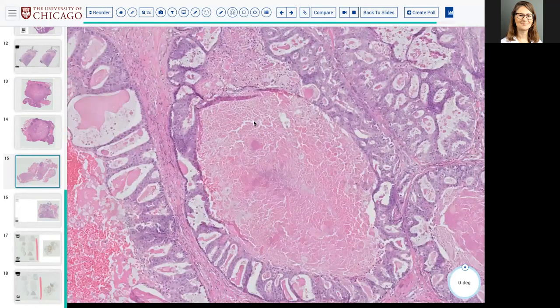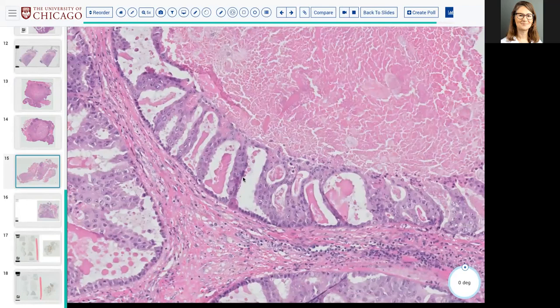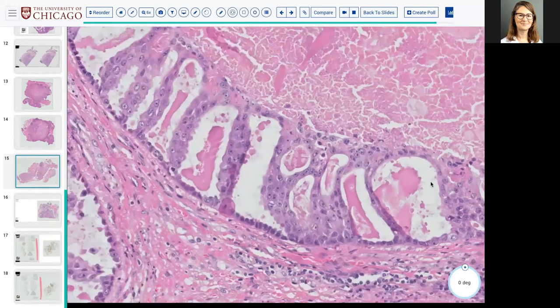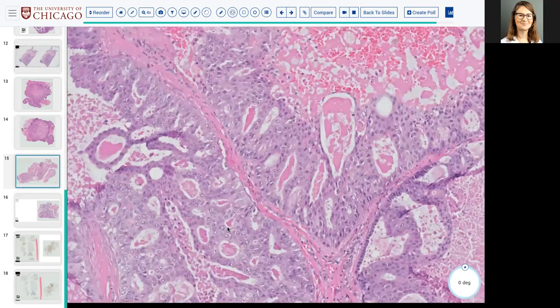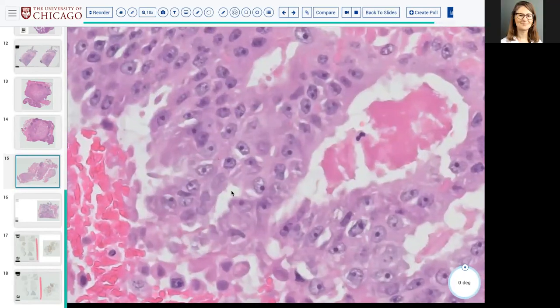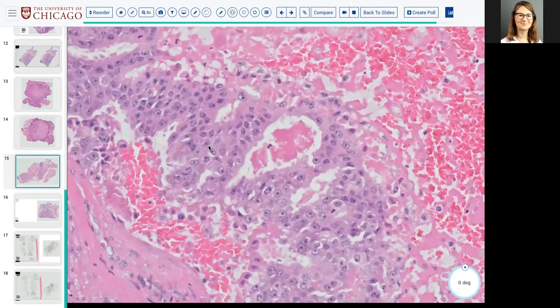What's different about the islands here with central necrosis is that the cells surrounding are not solid, right? They have what Mark Lingen calls Roman bridging, or otherwise we might call cribriforming. This punched-out hole pattern is very characteristic of so-called salivary duct carcinoma. In salivary duct, they tend to have an almost apocrine appearance, with abundant pink cytoplasm and really smack-you nucleoli, right?